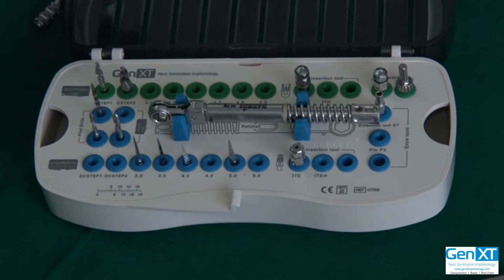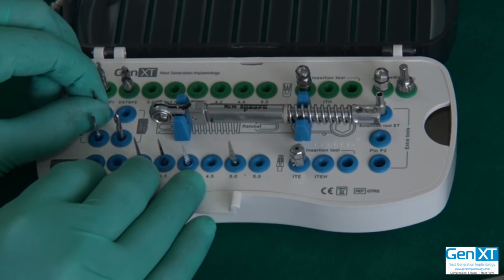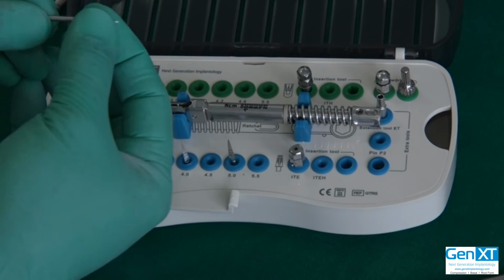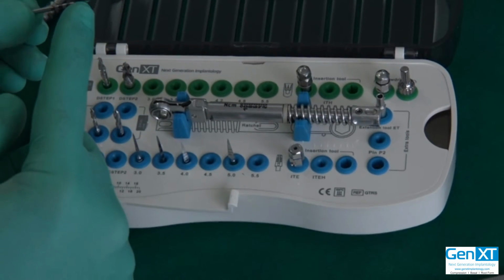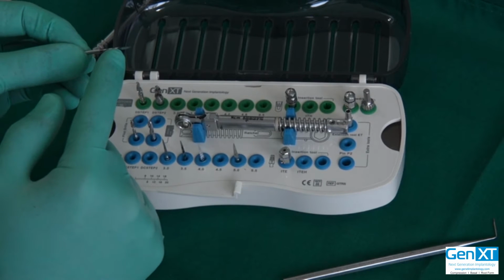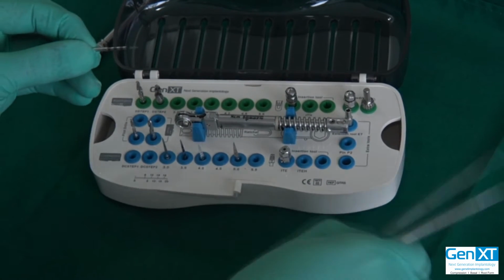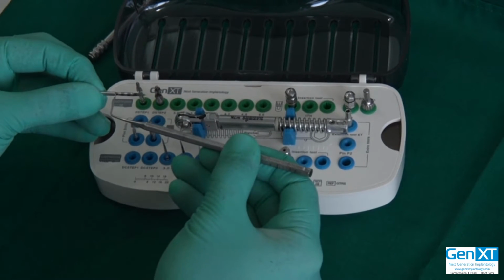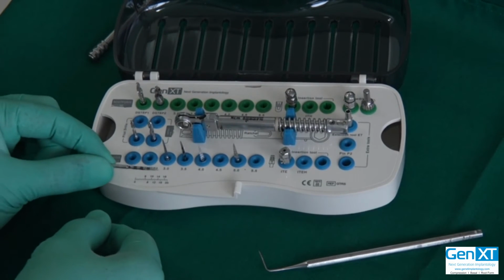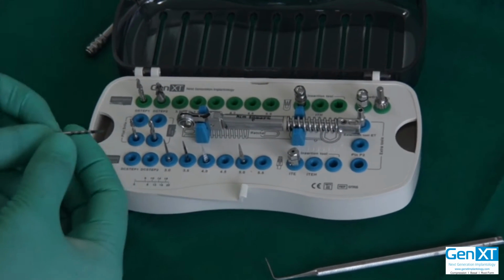So the drilling for the 2-piece implant, again you start with the precision drill. It's 2 millimeters in diameter. It has a sharp tip tapered at the end. It has markings again from 6 millimeters all the way up to 20 millimeters. And as I said, if there's any doubt, you can always put it against this graduated scale over here and you can get a reference.